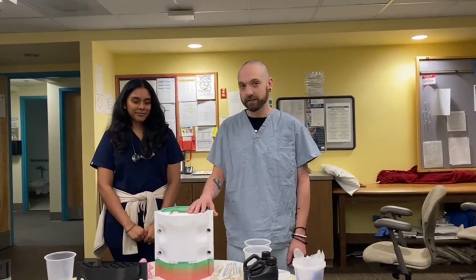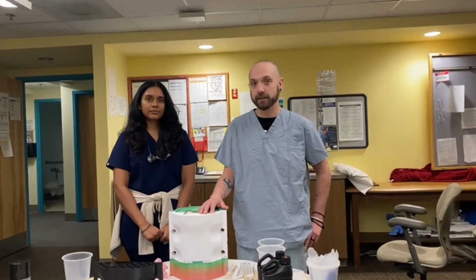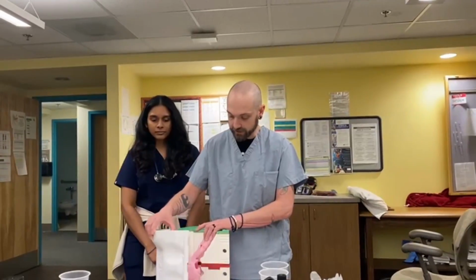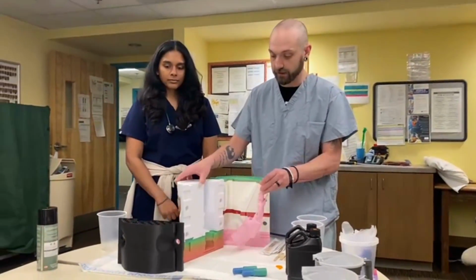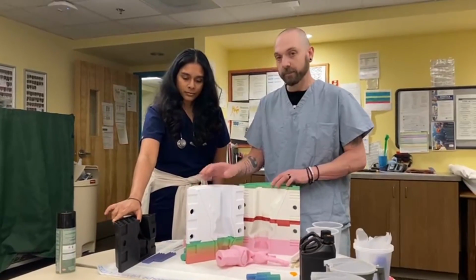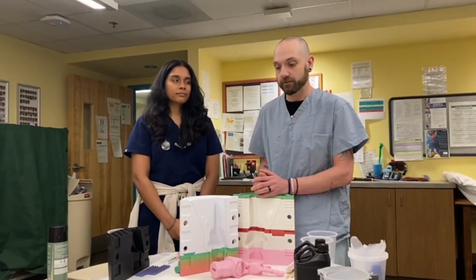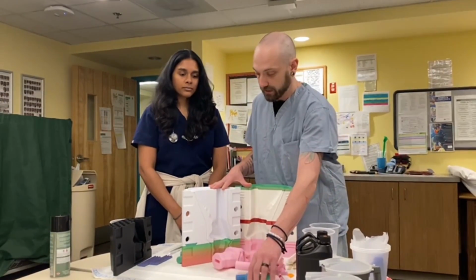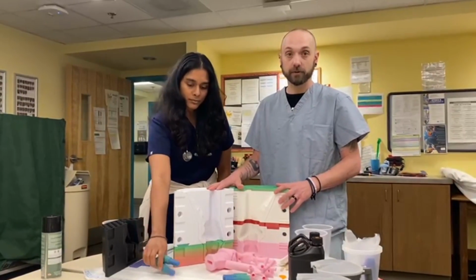All right, so we did this using two different freely available models on Thingiverse.com. One from Decent Simulator and another from DC Tink. They were printed on a very basic mid-level 3D printer that's available to anybody with very basic settings. So it ends up coming across as a 48-hour print in the end, using standard PLA with an estimated cost of about $50 to $60 for the entire model itself, including these large pieces, the negative space, and even the hardware to keep the model together while it's pouring.